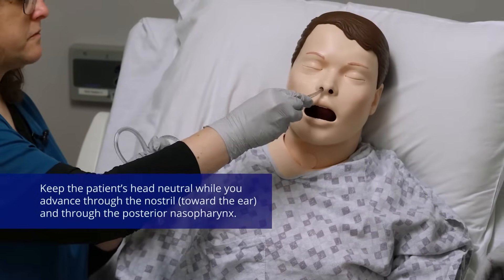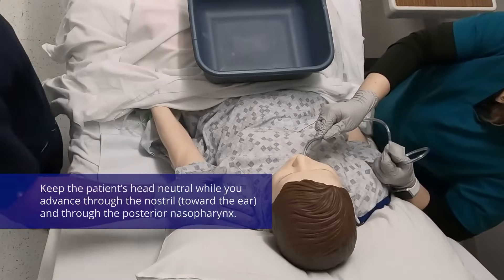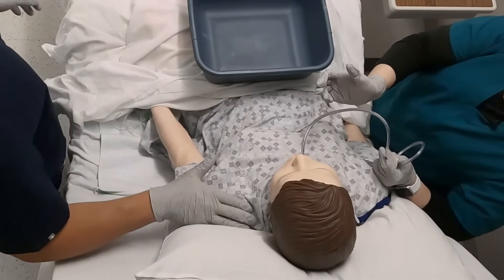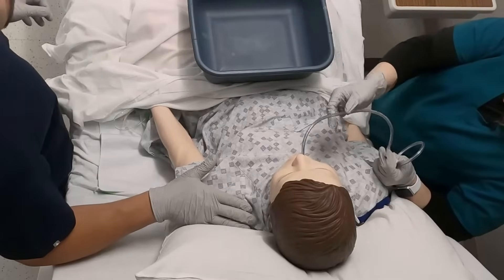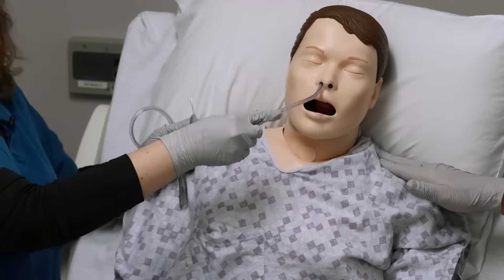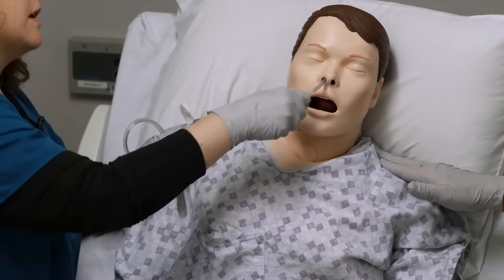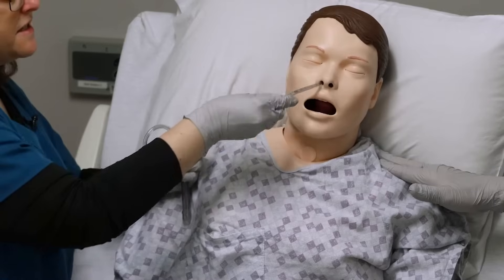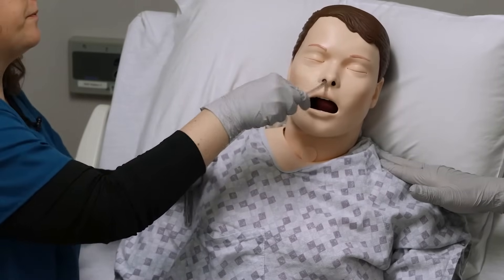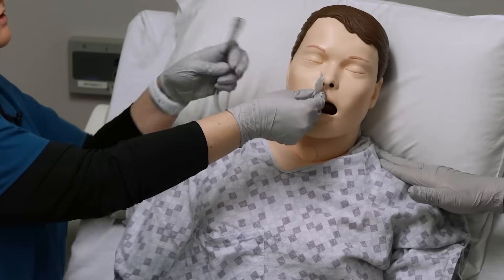We're going to go ahead and push this all the way down. This would also be the point where, if it was going into the trachea and the lungs, you can actually just lightly hold the tube and watch it. If she's breathing the tube — if it's in the wrong place — it's going to start to float in and out with every breath. If she has a lot of gastric distension, this is the part where you're going to start to see a lot of gastric juice inside the tube. Now I've gotten to where my mark was.